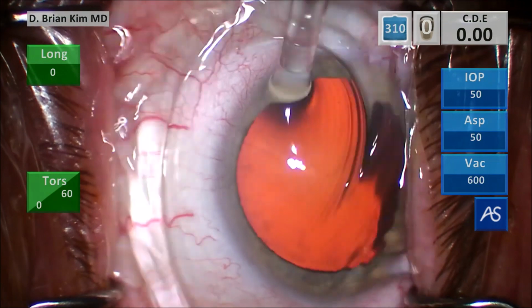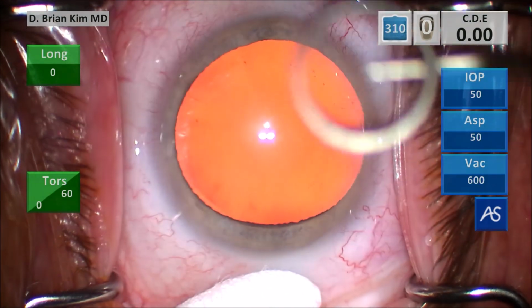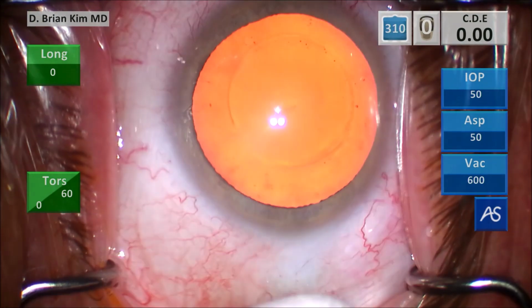So you can see this is the patient's left eye. There's somewhat of a Bell's reflex here. I'm able to have the patient look straight using the cotton tip to steady the eye, use a corneal marker, which will help me to center and size the rexis.